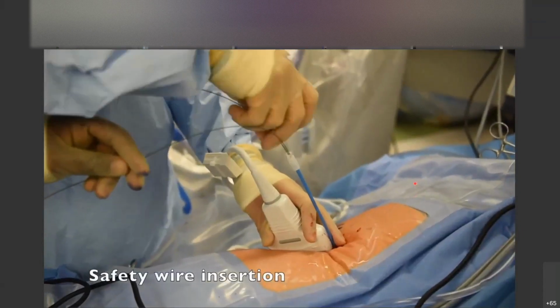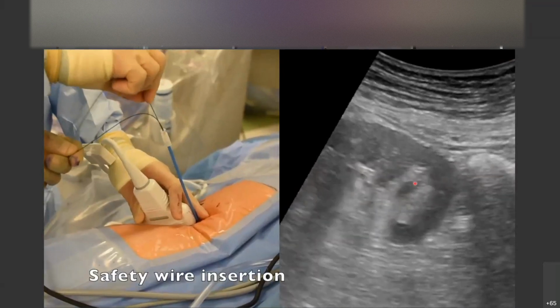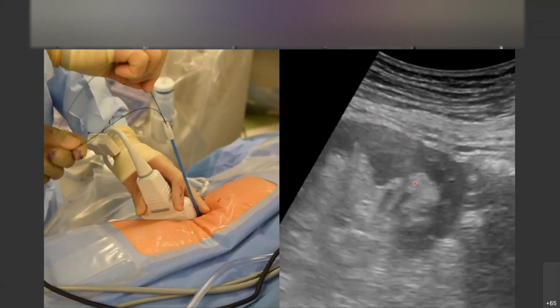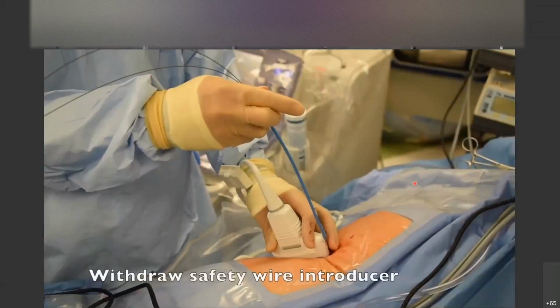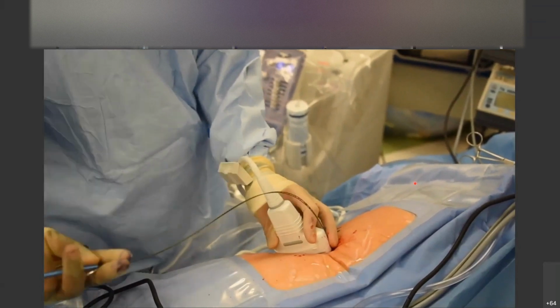Using a safety wire for this demonstration. You can see that wire again, sort of manipulating the renal pelvis there. It's a nice view. Back to the introducer off. And now we proceed with the balloon.